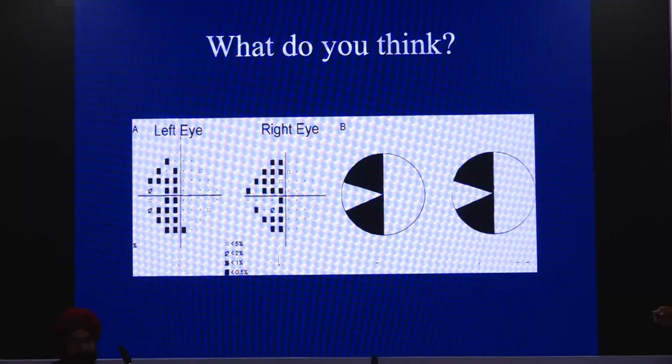What about here? This is a very specific pattern. These are rare, but they are more important, especially for residents or fellows who are going to write the exam. So these are the kind of defects. This is called sectoranopia, and this is generally a sign of a problem in the lateral geniculate body. You can either have a defect like this, or only these two triangles can be affected. Again, because of the blood supply, the way the LGB is supplied.